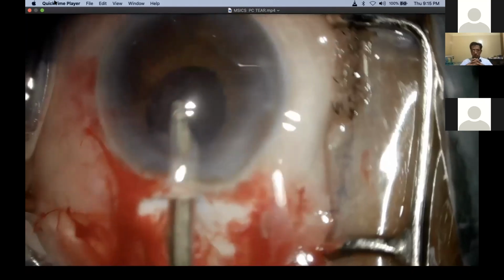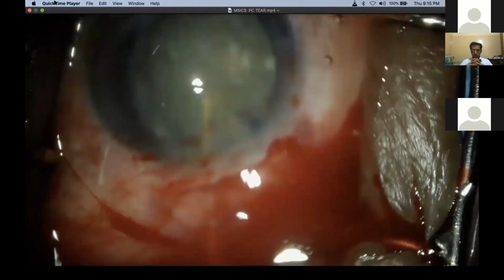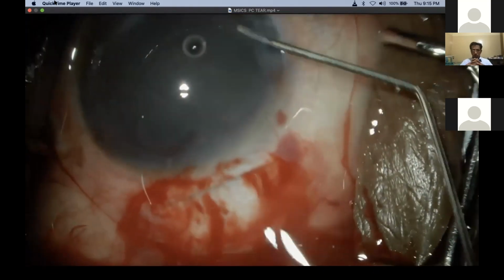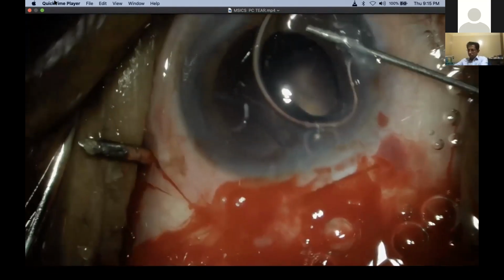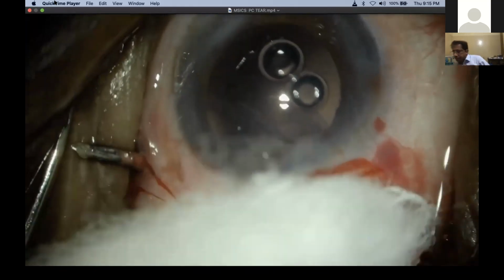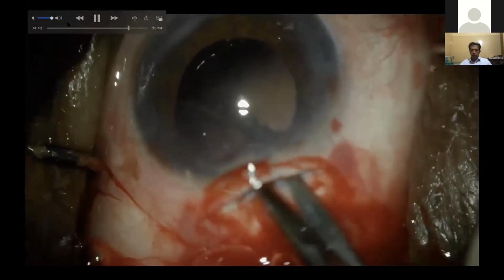In the two cases which I'm going to show, I ended up with a posterior capsular tear during a cortical wash. In both cases, probably during a cortical wash through the main wound, I pressed upon the posterior lip of the wound, and the posterior capsule came up, and my cannula pressed on the capsule, giving way to a capsular tear. In the first case, I did a manual vitrectomy after injecting triamcinolone, and an iris claw lens was placed. The same thing happened in the second case during a cortical wash, and again my cannula pressed on the posterior capsule, giving way to the capsular tear. In the second case, I placed the lens in the sulcus. There was no vitreous disturbance in the second case.